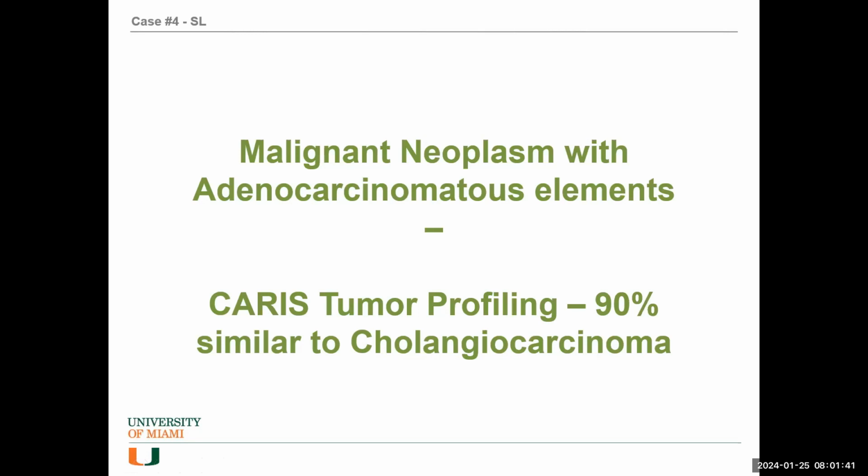It is interesting, though I'm not surprised to see this. It was cytokeratin 7 positive, which, if you're thinking of a GI tract, a lower GI tract doesn't make sense. The best fit would be a cholangio, actually. But it doesn't look that aggressive histologically. It doesn't have a single mitotic figure. It doesn't have any histological attributes of aggressive behavior. Very strange looking. Looks almost like an adenoma in some areas.